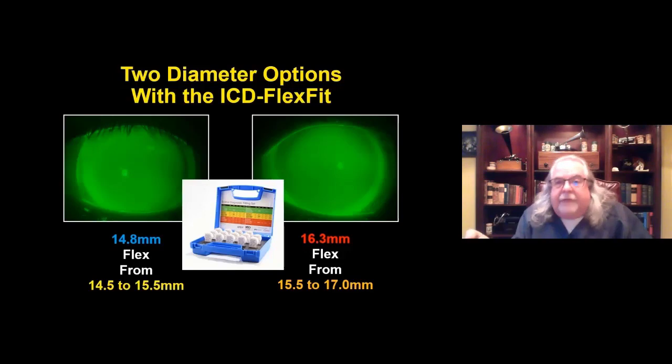In many cases, the 14.8 and the 16.3 are perfectly adequate. But having that little extra ability to increase the 16.3 millimeter lens to 17 millimeters or decrease it to 15.5 is really a wonderful feature in the contact lens.